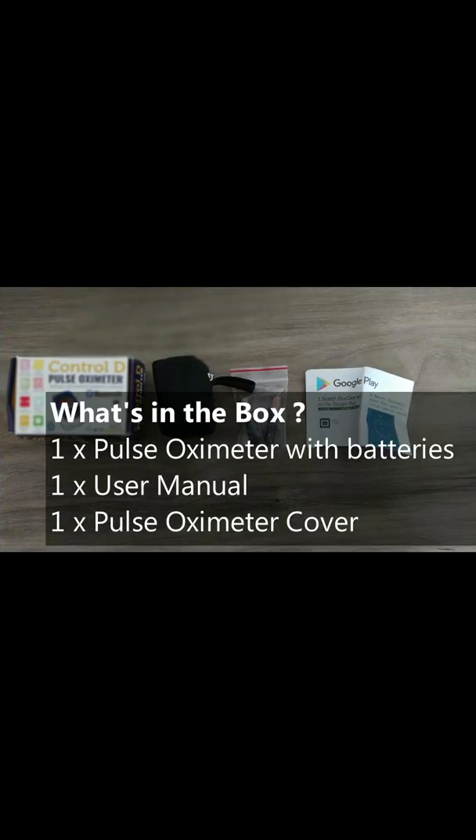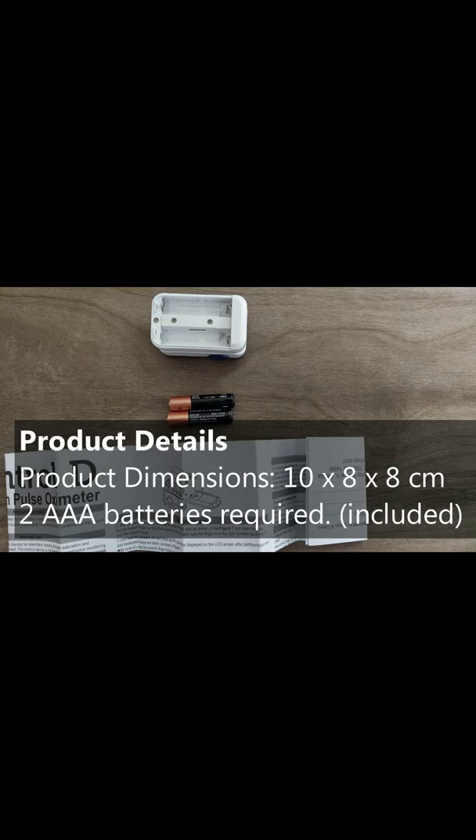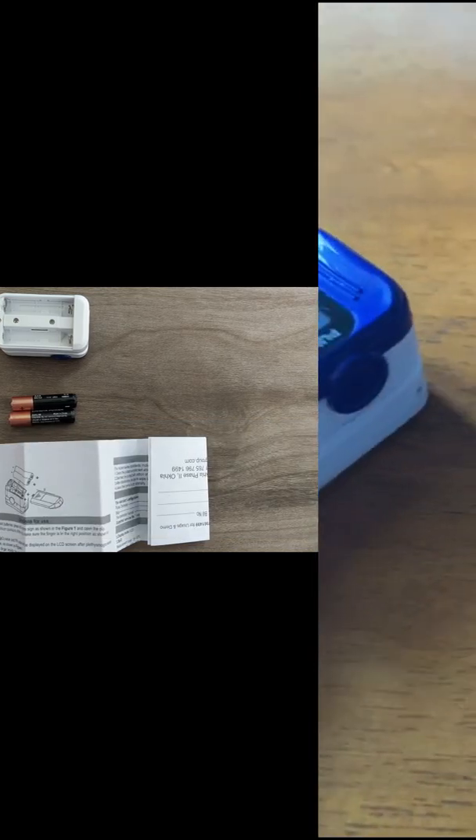You open the box and you get three-fourths of your index finger size oximeter, a travel pouch, two batteries, and some instruction manuals. The oximeter runs on two AAA batteries — I kind of like that, but it depends on you.